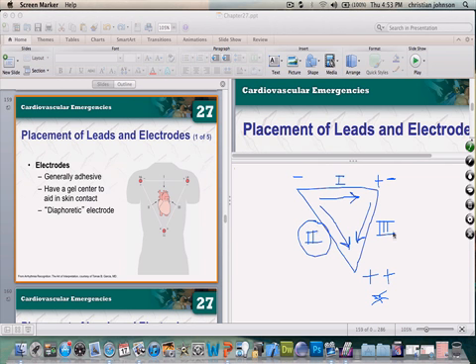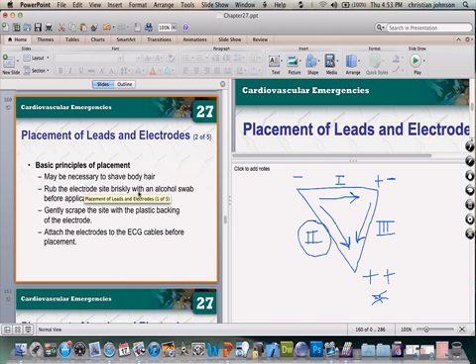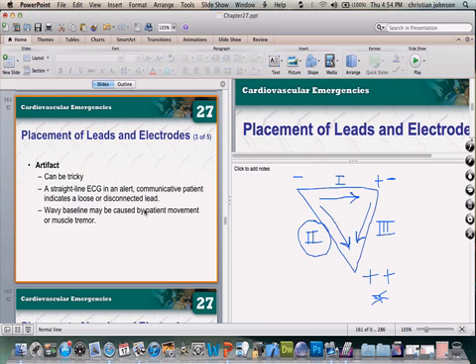Going over our PowerPoint here, we have gel-centered diaphoretic electrodes. Our patients might be diaphoretic, in which case the electrodes won't stick. We have things on the truck like benzoin that will help us stick the electrode to the patient, so we get a nice clear view of the patient's electrical activity. You may need to shave their body hair. You may need to tell the patient to stop taking such deep breaths or not move, or maybe even park the truck because of 60 cycle interference. That might prevent us from getting an accurate EKG.